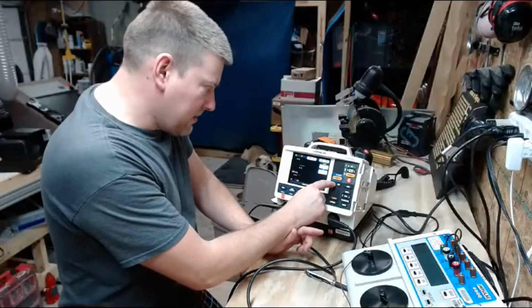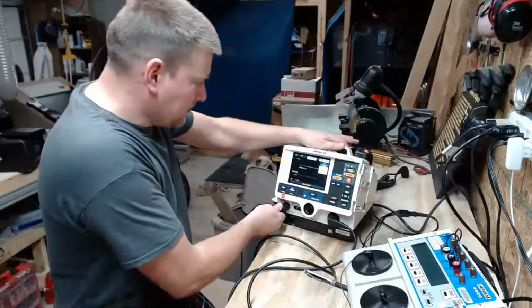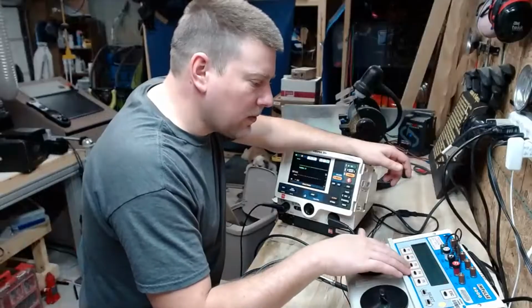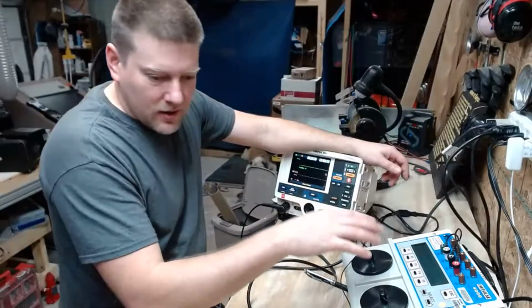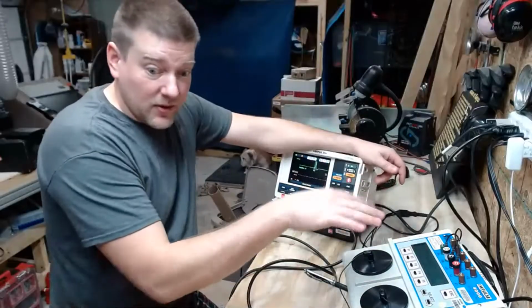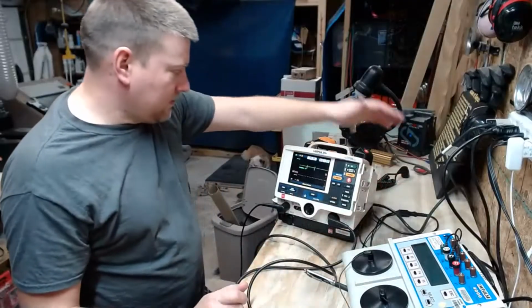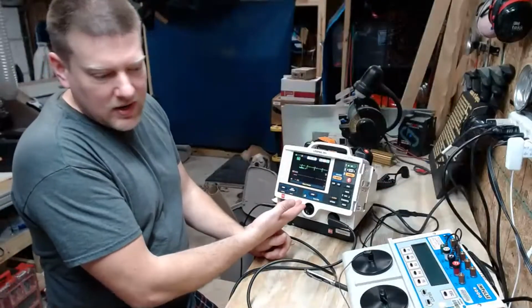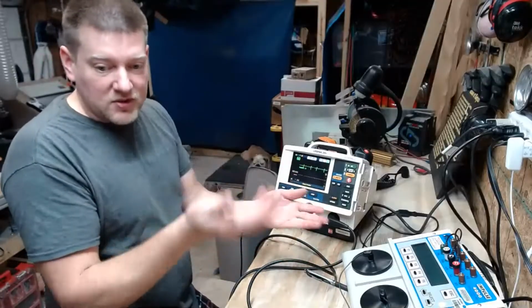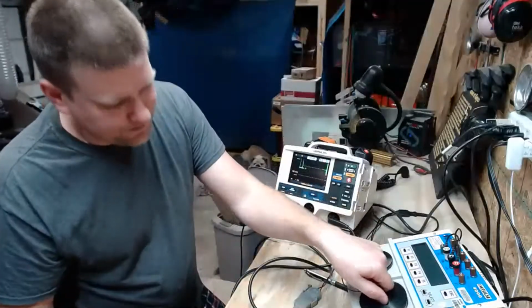So I have nothing on it, so I'm going to select paddle. Escape, escape, escape, go back. I really like these raised buttons on this analyzer. It allows me to go through these tests really quickly. So normally 60. Okay, guys, you can see right here, these aren't labeled, but I have an inverted sinus rhythm, which tells you I have the polarity wrong. So I'm going to switch them back around.